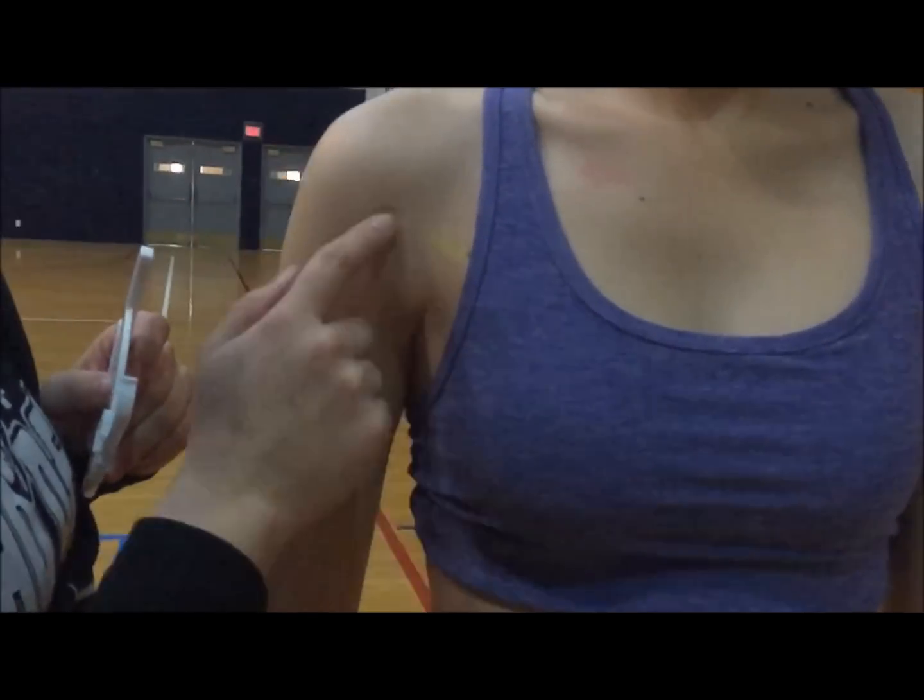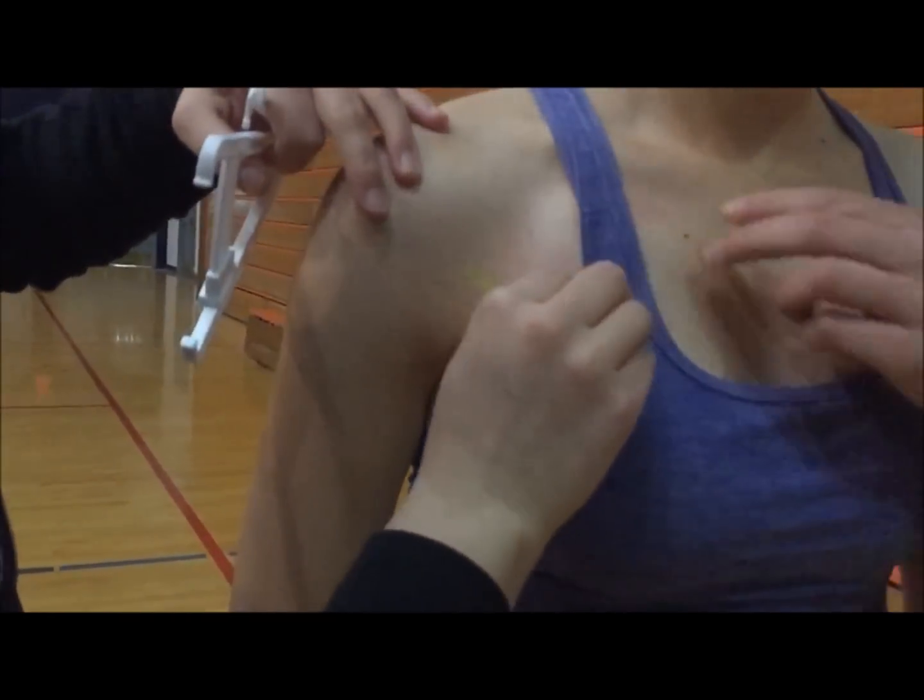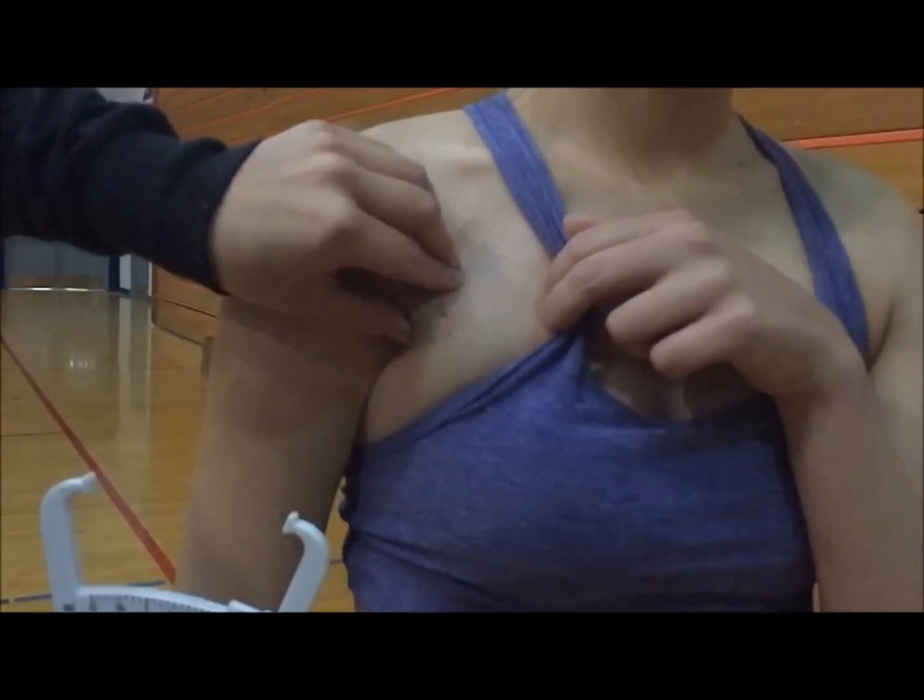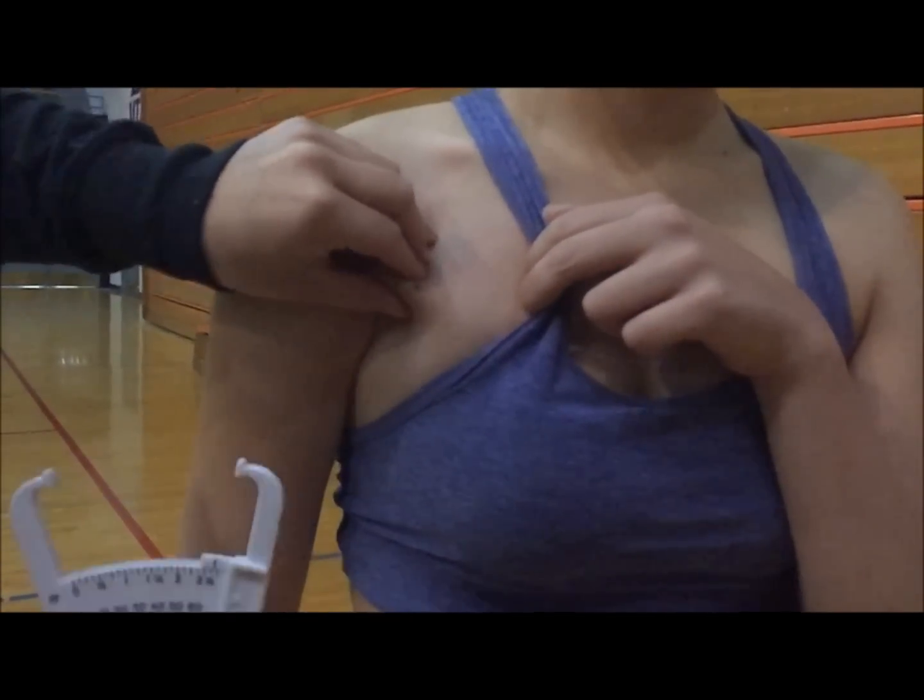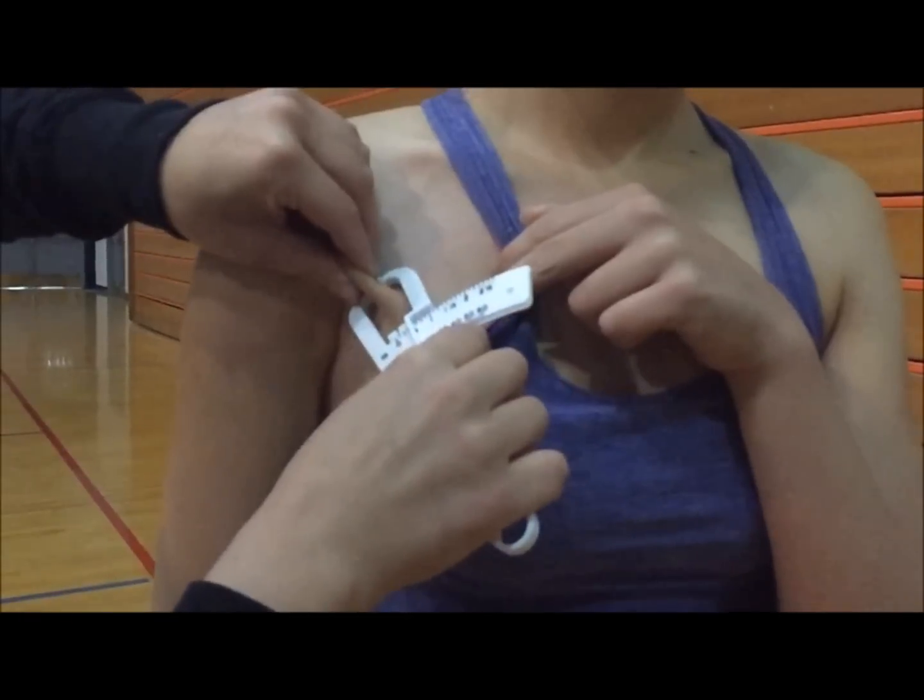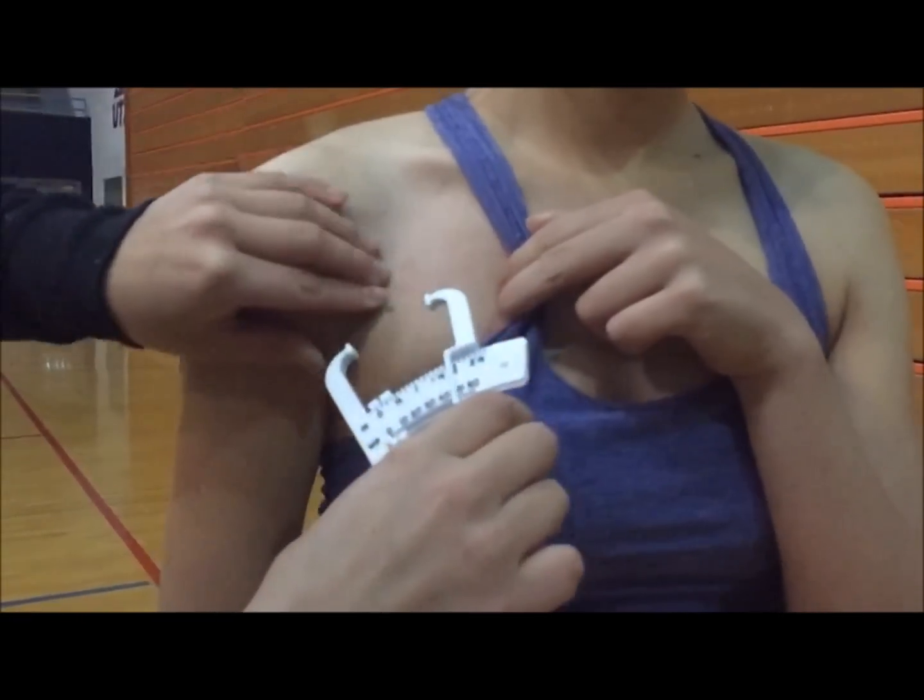Next, we will do the chest area. You may have the subject hold the bra if it is a female to help out. Make sure that you are doing a diagonal fold, maintaining the pinch, of course.